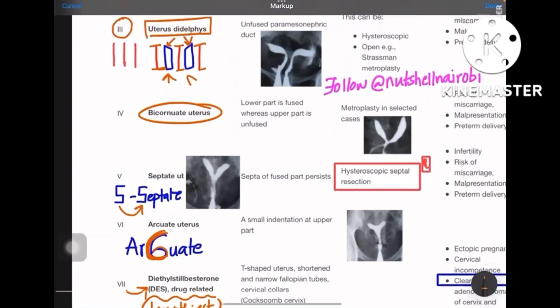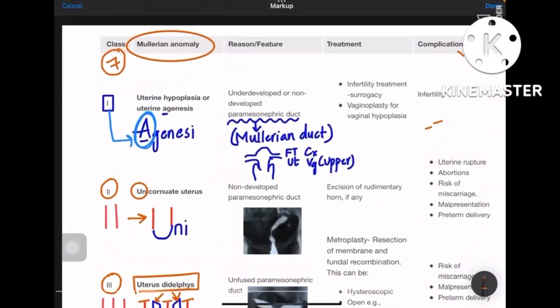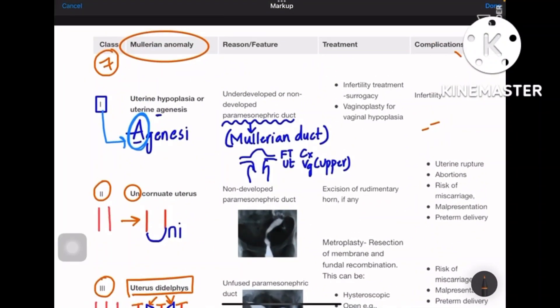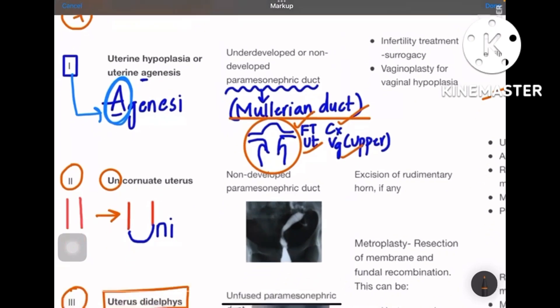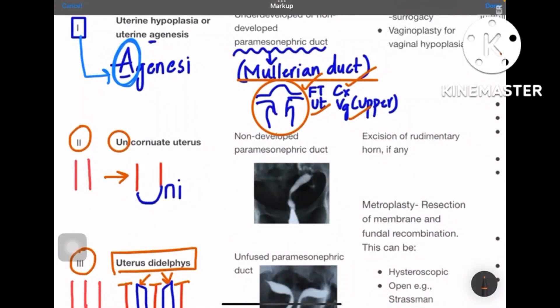Class 1 is uterine hypoplasia or uterine agenesis — under-development or non-development of the paramesonephric duct. Structures from the Müllerian duct include the fallopian tube, cervix, upper vagina, and uterus. Class 2 is unicornuate uterus — one side is non-developed while the other side's duct is normal, giving one uterine cavity, one cervix, and one vagina on only a single side.